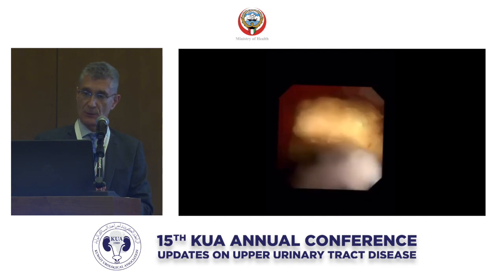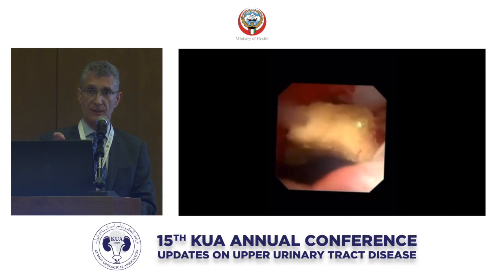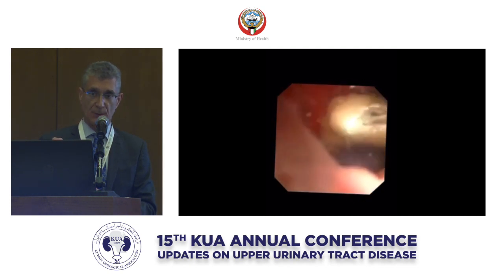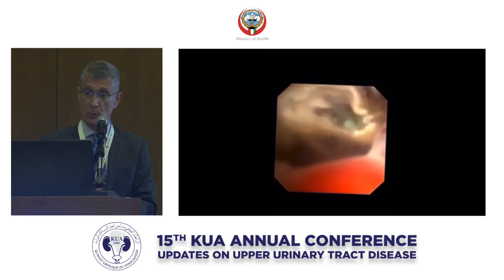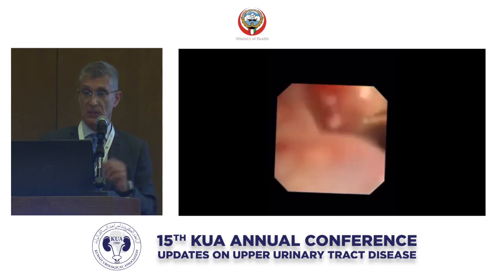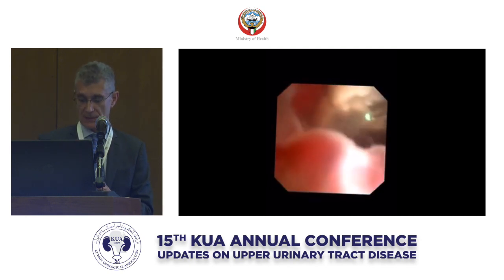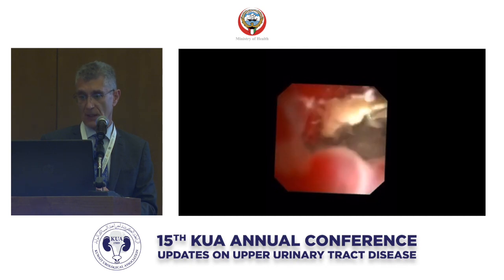And the other thing I think to notice here is that for most of this procedure, the laser is actually not even in contact with the stone, and it's still producing its effect. I think that's another key element here. So you can actually produce ablation of these softer stones. I think that's how the dusting technique actually works the best, when you're not actually driving it into the stone, which usually causes the fragmentation, and then you have to treat the bigger fragments. This allows you really to treat the surface and produce that fine dusting, which I think is the goal with this particular laser. So that's another advantage.